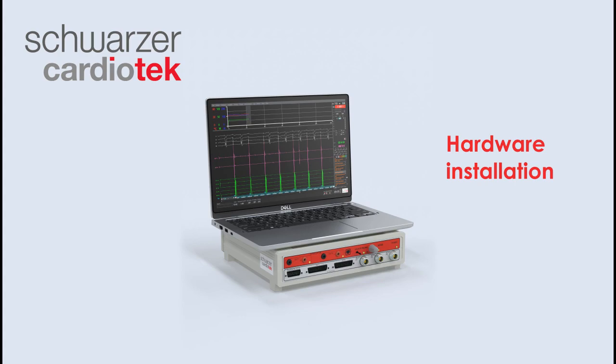Welcome to this video, where we dive into the hardware aspects of the EP Tracer system. In this presentation, we'll guide you through its main elements, cabling and startup procedure.